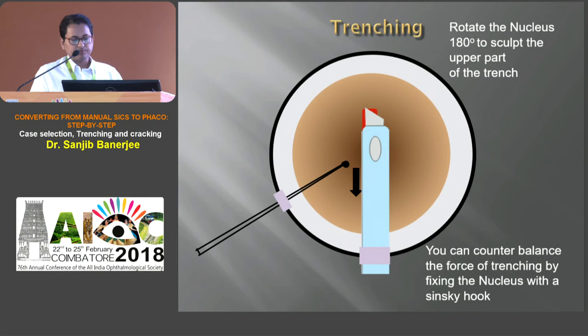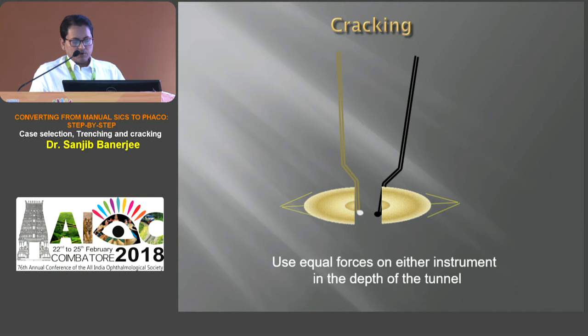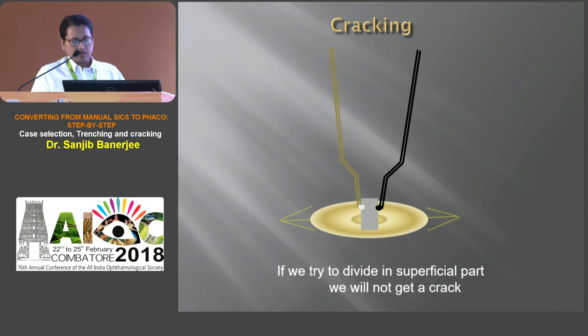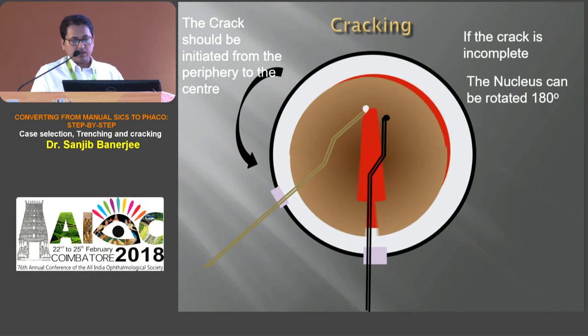If we apply more force at one instrument, there will be traction on the opposite zonule. While cracking, if we place the instrument at the superficial part of the trench it will be very difficult to get a crack. Cracking should be initiated from the periphery of the trench tunnel, and if it is incomplete, rotate 180 degrees and complete the cracking from the other part of the trench. The center is very hard so it is very difficult to crack from the center — moreover we do not get a good fulcrum there.